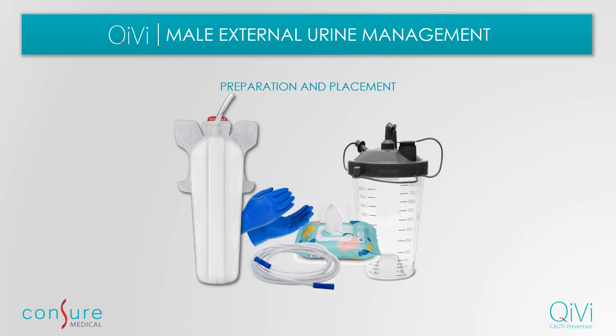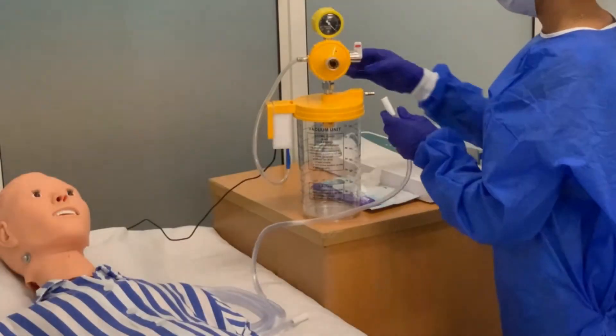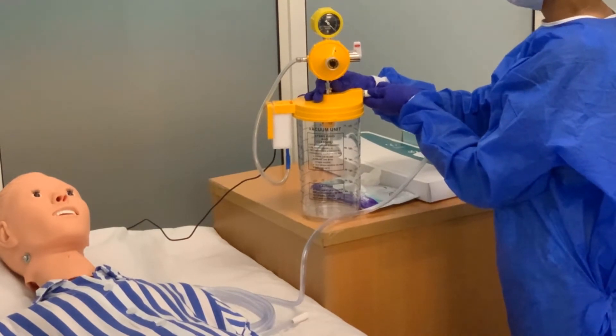To apply the device, gather the necessary supplies and set up the station close to the patient. Connect the suction tube and turn on the vacuum suction pump to 40 millimeters of mercury.